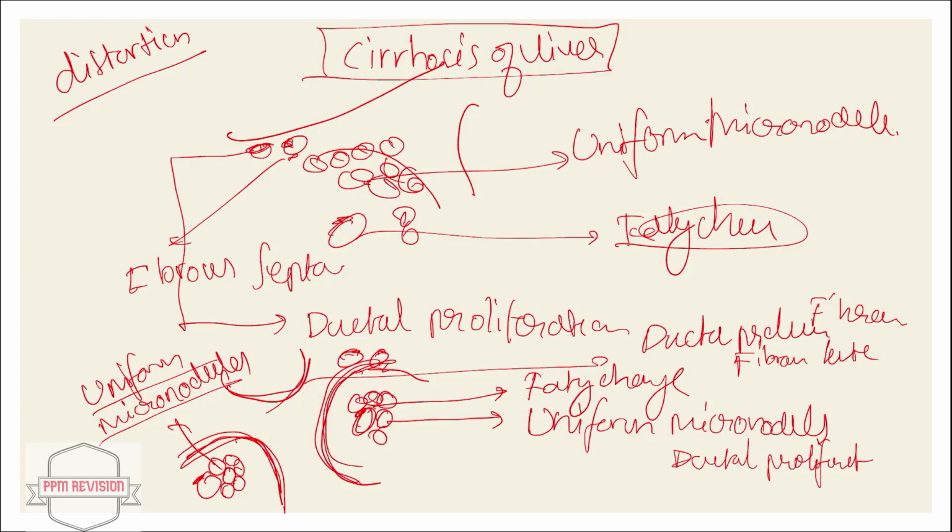Now looking at the next point, the fibrosis is replacement in character. In other places it resembles the granulation tissue, being vascular, fibroblastic and irregularly infiltrated with round cells. So what we have seen is they have formed some particular island-like structures, right? There are bands which intersect the liver making it into several islands or nodules, and there's presence of fatty change and presence of uniform micronodules.